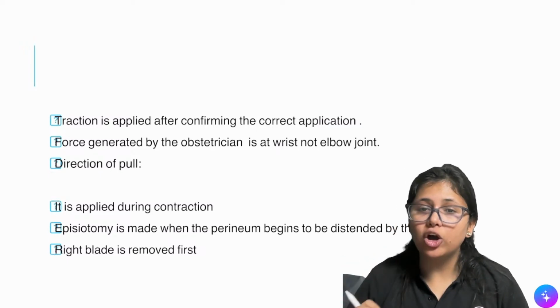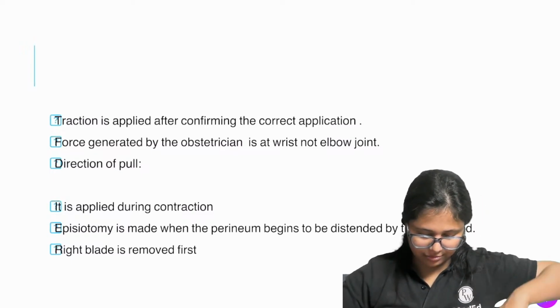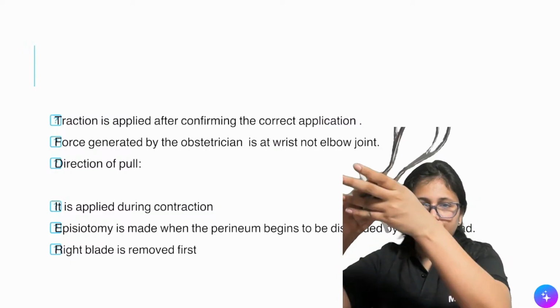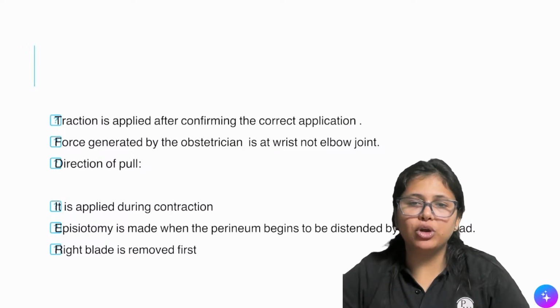Right. Now let us talk about the pull. How should I pull? Should I pull like this? Should I pull like this? How should I pull? So direction of pull is important, right?